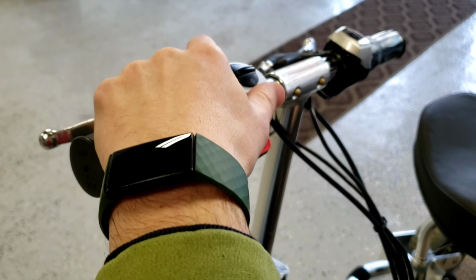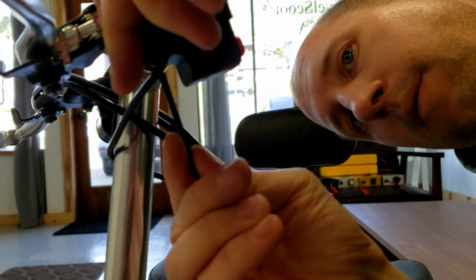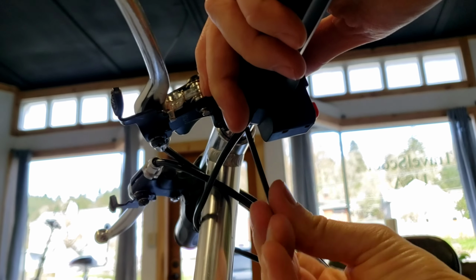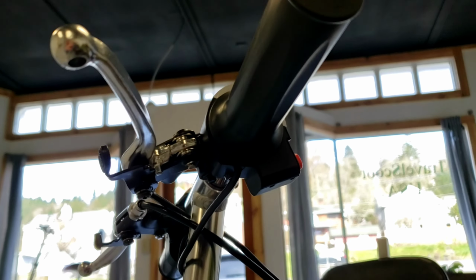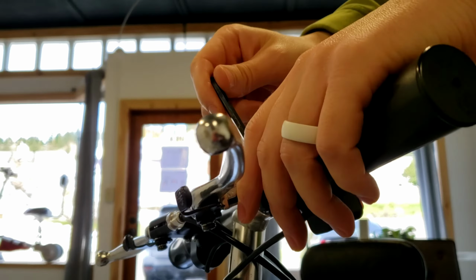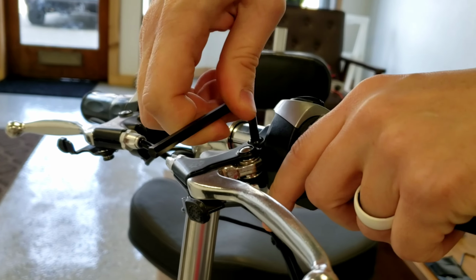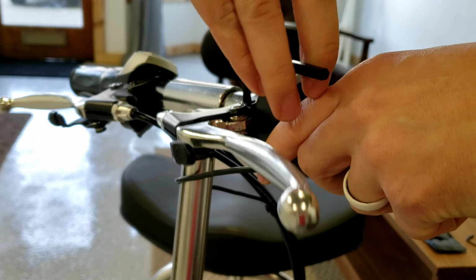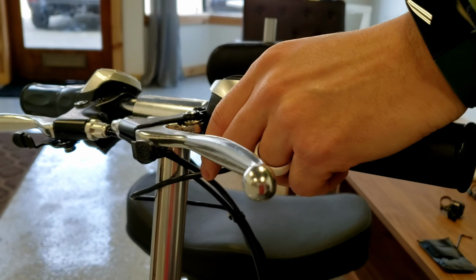Once that's off, we're going to come underneath and we're going to undo the on-off switch. Next, we're going to grab the largest Allen wrench and unscrew the brake. Once we've done that, we're going to move everything to the inside.